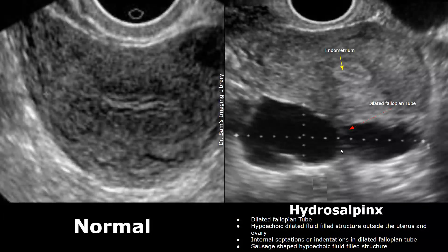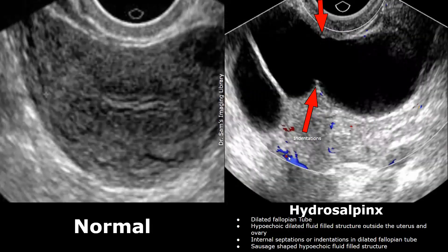Hydrosalpinx is a condition where a fallopian tube becomes blocked and filled with fluid. This can result from infection or other causes, and it often affects fertility. A normal fallopian tube is not visible on ultrasound. Hydrosalpinx appears as a dilated, fluid-filled, hypoechoic structure outside the uterus and ovary. This structure will have internal septations and indentations. Here is another image showing internal septations and indentations in a fluid-filled structure found outside the uterus and ovaries.